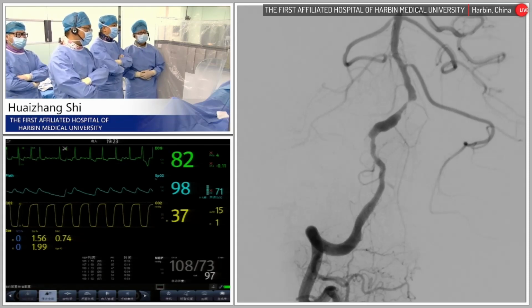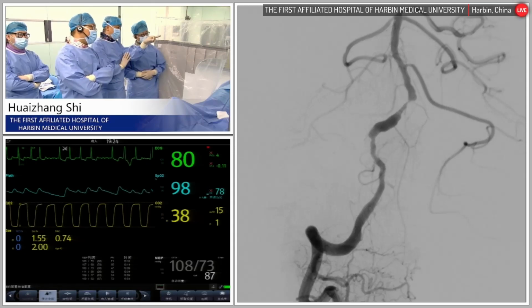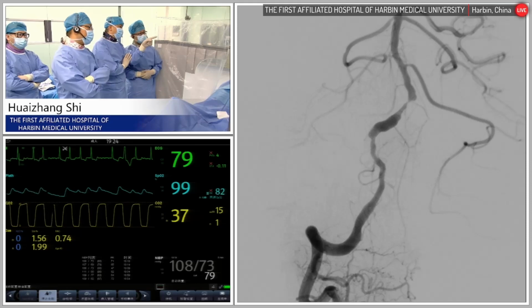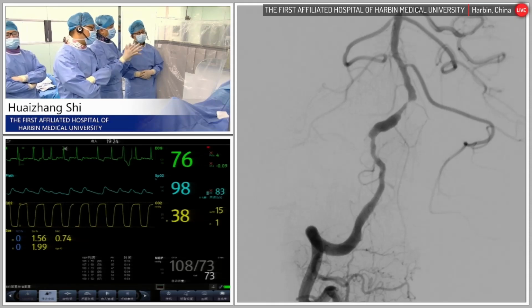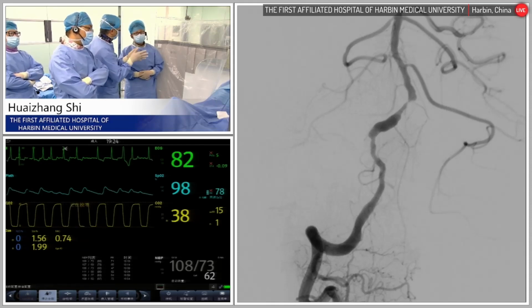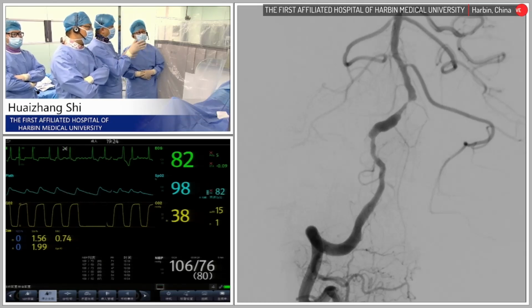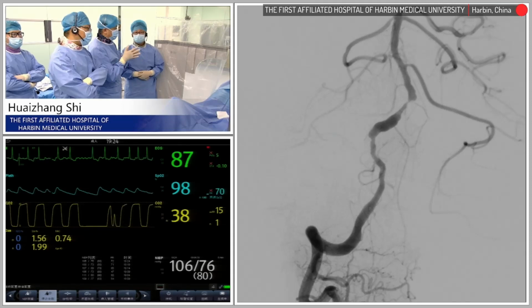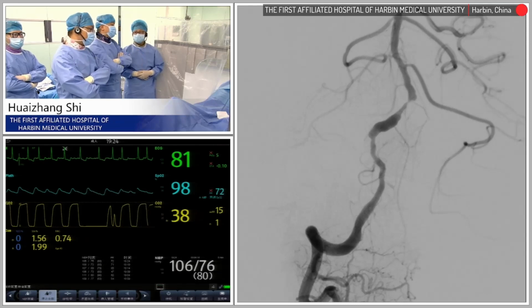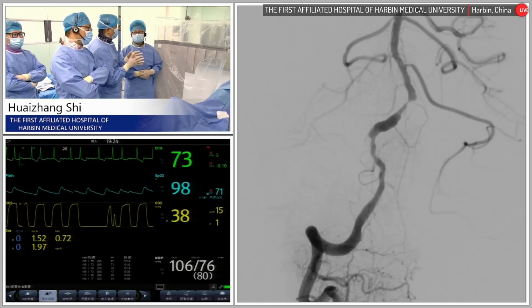And for this case, I think the most important thing is the first lesion close to the junction. We should know if it's atherosclerotic stenosis or if it's hypoplasia. If it's a hypoplasia, after we inflate the balloon to treat it, maybe the result is a disaster. Maybe it's ruptured. From the DSA, we can't tell the result clearly.